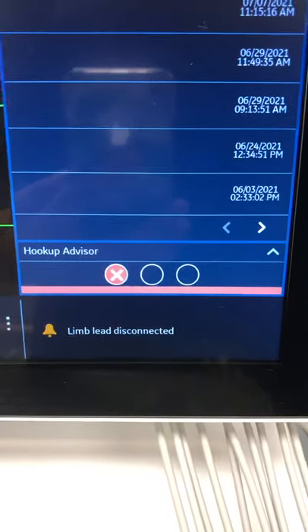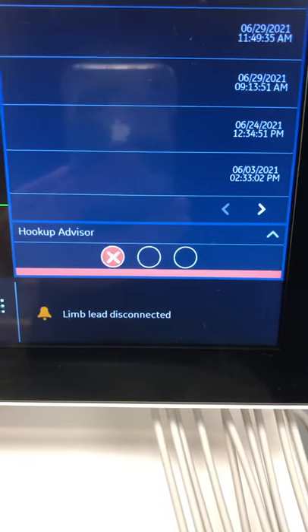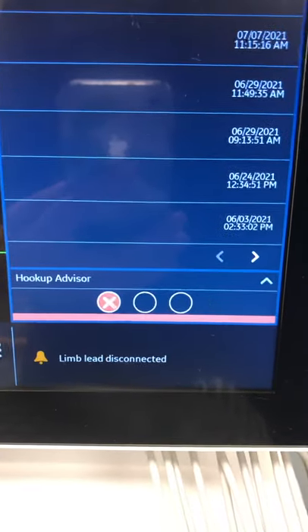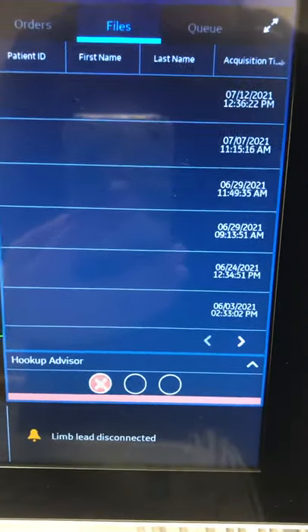If you leave the electrodes and leads on for more than 10 seconds and the picture is good, the EKG machine will automatically take a picture for you.